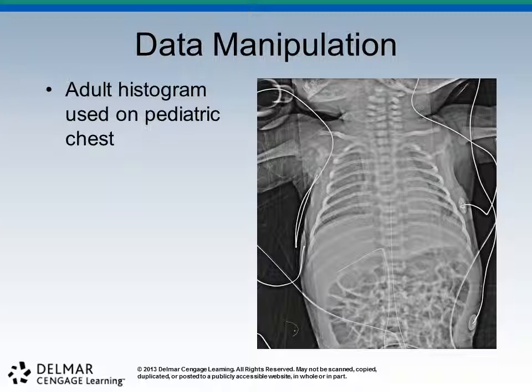What I described to you yesterday, I said the computer knows where there's supposed to be areas of darkness outside the patient, lighter areas in the soft tissue, inside the patient, the spine, the heart, back. It's reading left to right, very simplistic. And if these densities don't match up with what the computer expects, well, it'll fix them. It'll make them match up to that. And that's a histogram error. Fortunately for us, that just means we'll go back and reprocess. But it used to be that we'd have to go back and restudy the patient. Dose is the problem on that. So now we don't have to, thankfully.